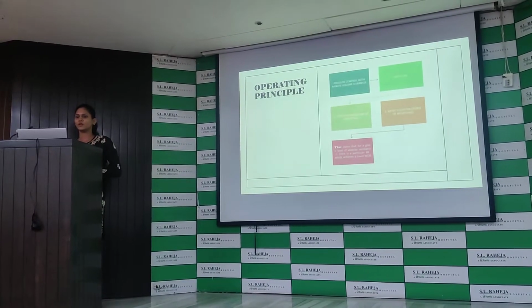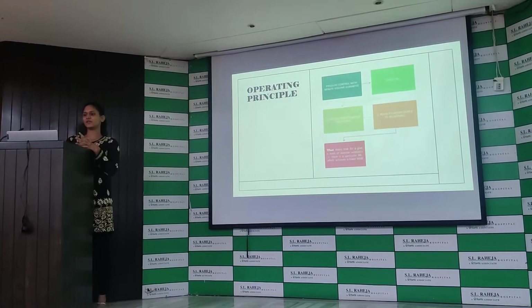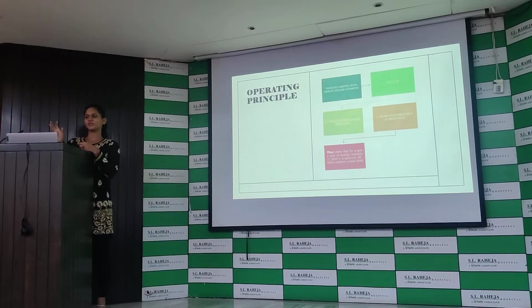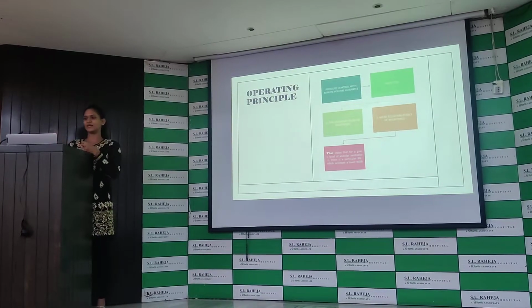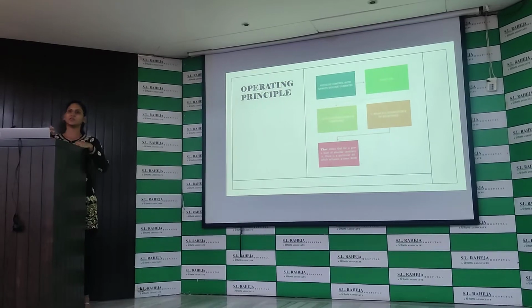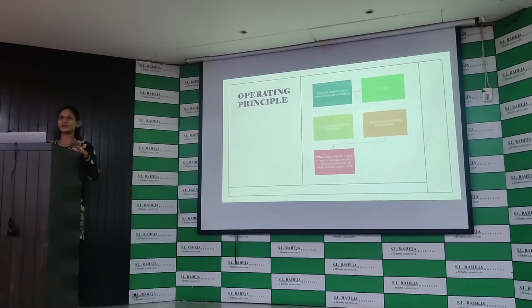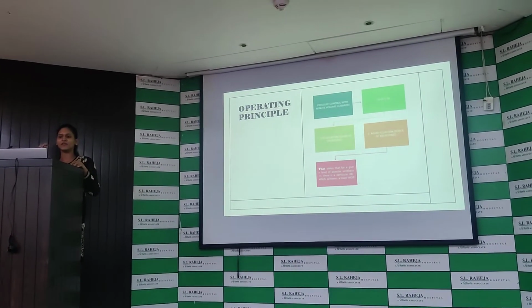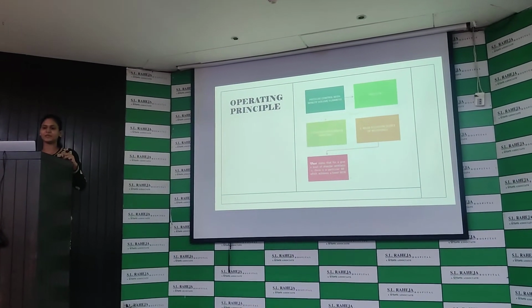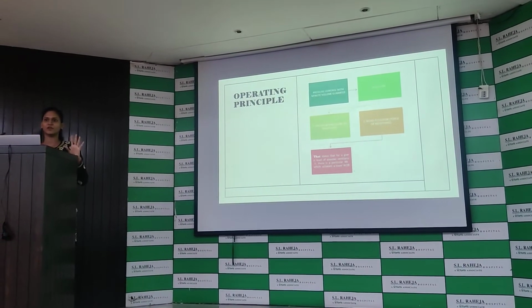So what are the operating principles of this mode? This mode is pressure control with a minute volume guarantee. It is based upon two equations, the Otis equation and the Mead equation. These equations date from 1950. They state that to give a level of alveolar ventilation, there is a particular RR which is required to achieve a lower work of breathing.